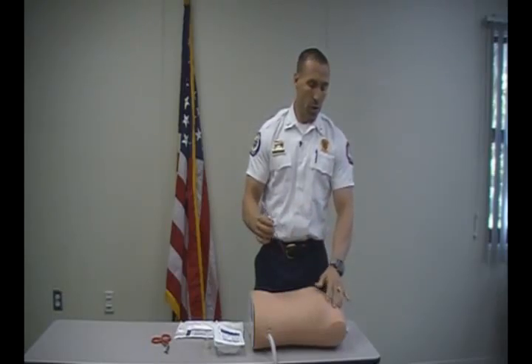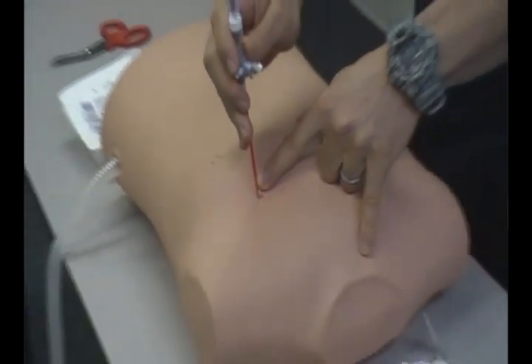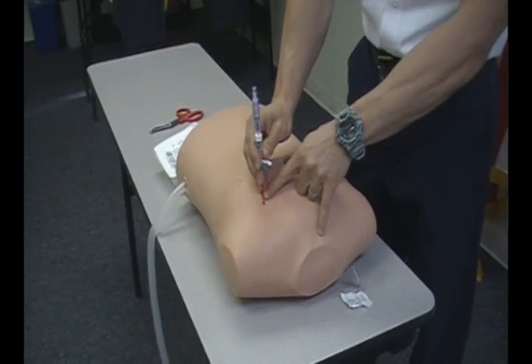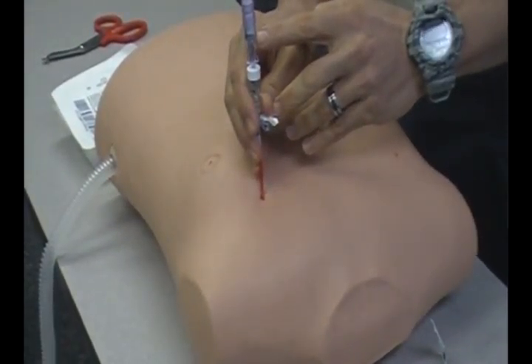So again, locate our landmark. We're going to go in at a 90 degree angle just over the 3rd rib. You can see when I go to touch the skin that it turns the indicator red. We're going to go in. We're going to get that rush escape of air, and we're also going to see that the needle indicator turns green.